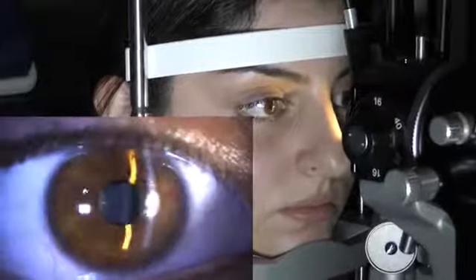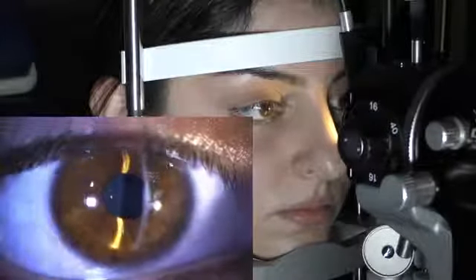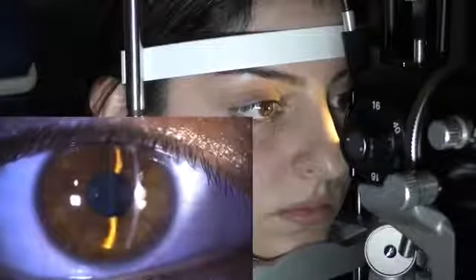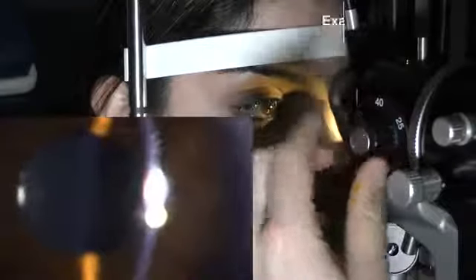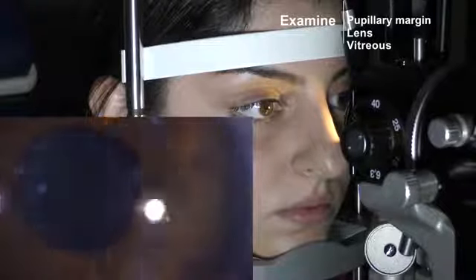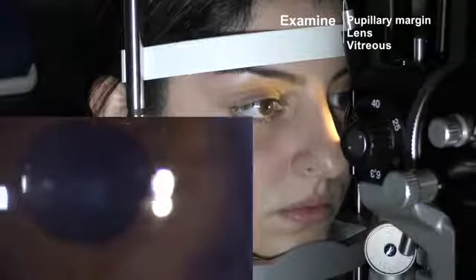Now, very importantly, we're going to look at the anterior chamber for cells and flare. What I like to do here is keep my beam nice and thin. You want to increase your magnification because we're going to look right through the pupil. Look at that beautiful view. Then, remember the knob I showed you to make the beam height lower. So now I've decreased my beam height.